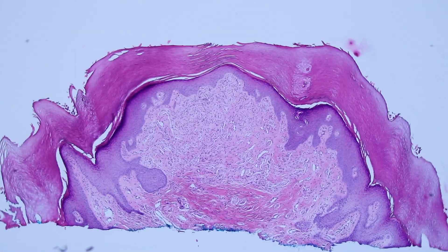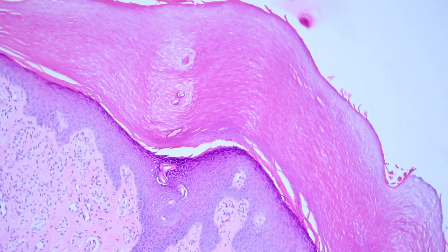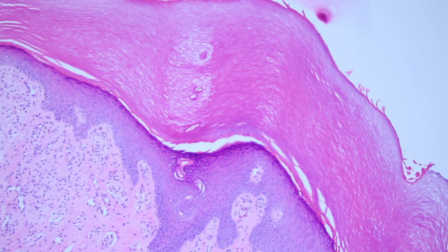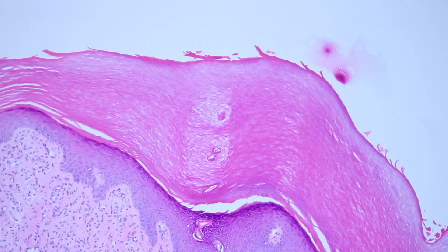It's a little bump coming from the skin surface. You can see this nice little swirly thing — those are called acrosyringia, or acrosyringium is the singular. That's where the eccrine sweat ducts drain out to the skin surface. I think those are really pretty, and you can see the little tube going up there into the surface — so that's an acrosyringium.